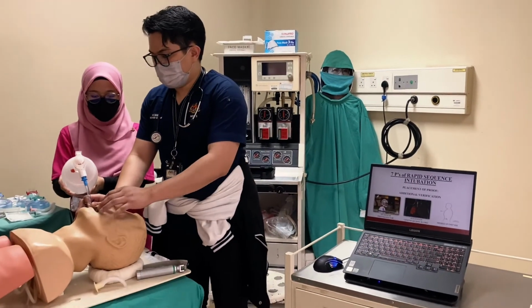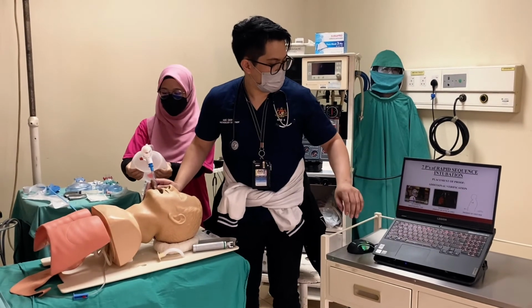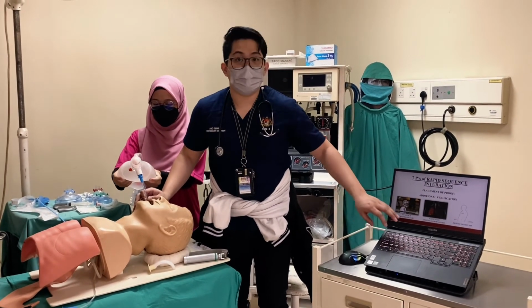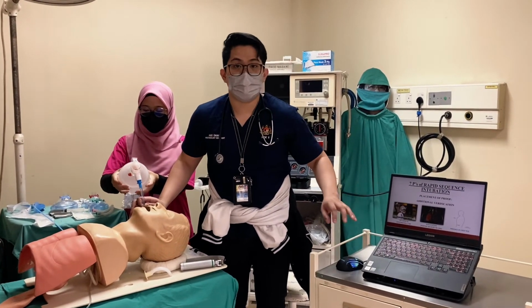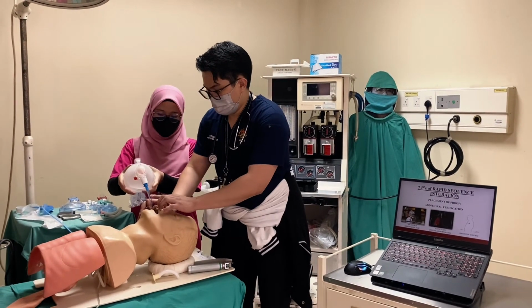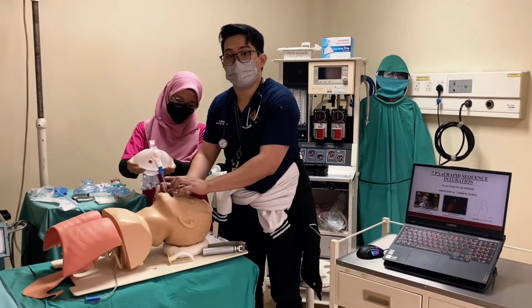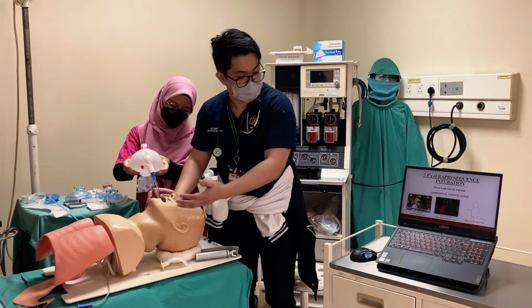And the second one is, okay, continue. Now continue bagging. The additional verification is based on these three that usually we will look at. First, the air vapor in the endotracheal tube. It means here. Unfortunately, because this is not a live patient, we will not be able to see it. This is just a mannequin.